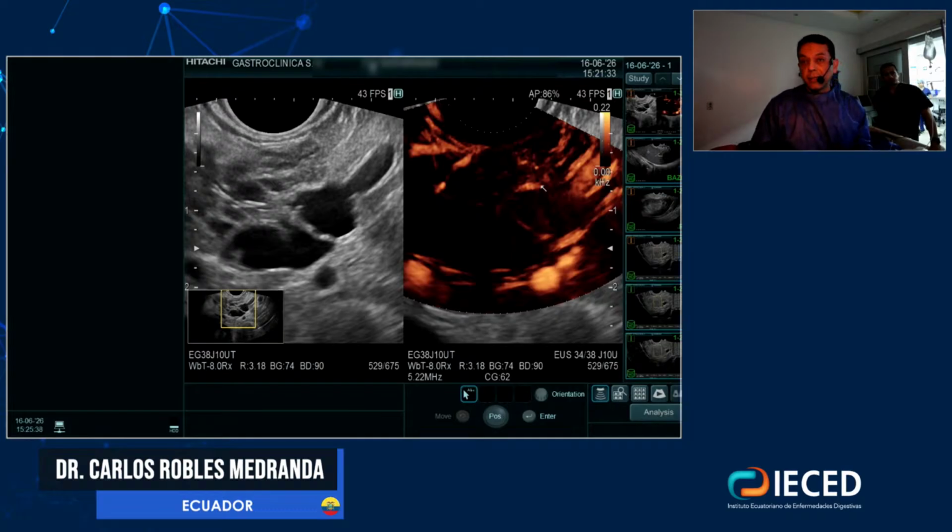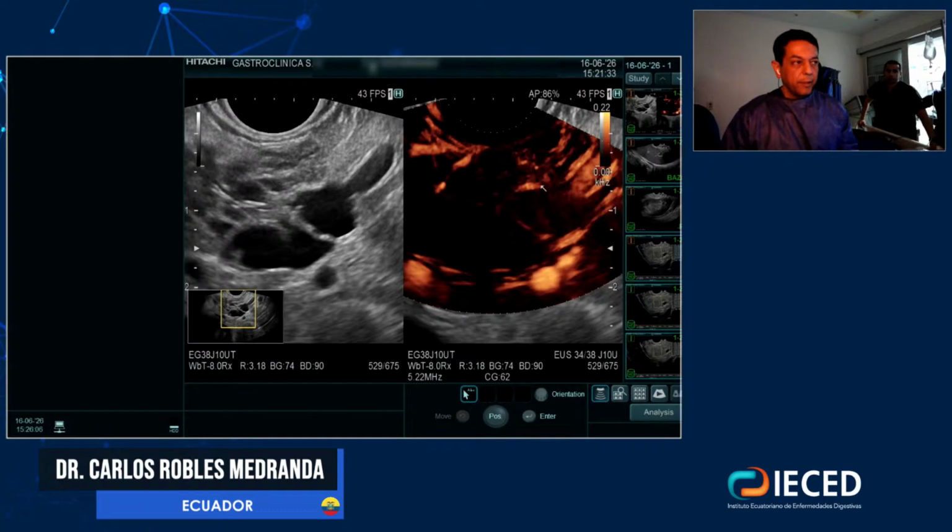But from the other side it is very interesting, because I believe that in angiogenesis, in whatever disease, microvascularization and angiogenesis or neovascularization is very important. So the micro details of the vascularization can help us to have an objective way to measure or to define the nature of the lesions in general practice.